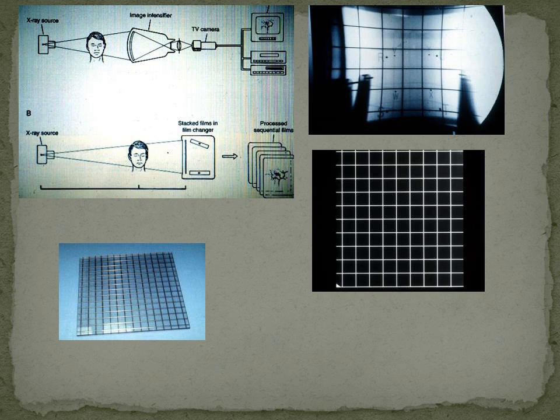Now, the real reason why we gave up angiography was that we started losing the ability to do film. And there was a period of time when you went down the angiography, you had this really interesting system. You'd have a film cassette underneath the patient and a film cassette lateral to the patient. And they would do a run. And when they did a run, you'd hear chakunk, chakunk, chakunk, chakunk. And that was a film changer changing film after film after film. And you could get about 4 films a second through that system before the films would buckle and they wouldn't feed properly.